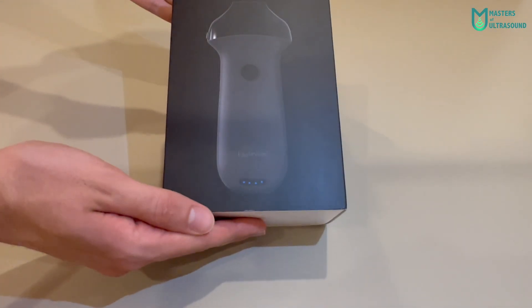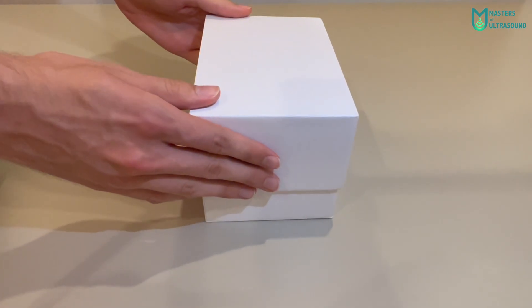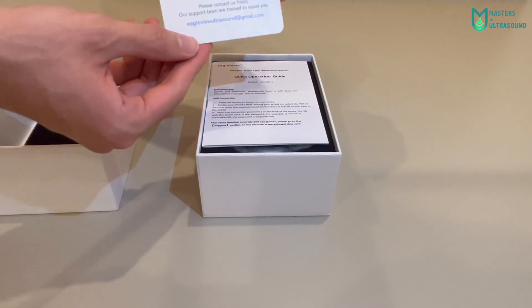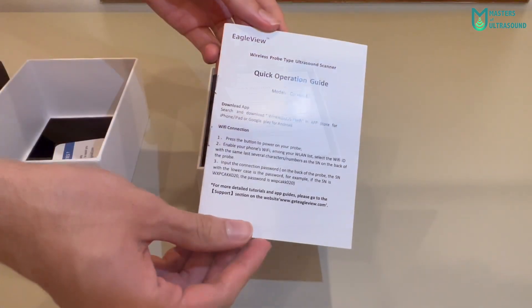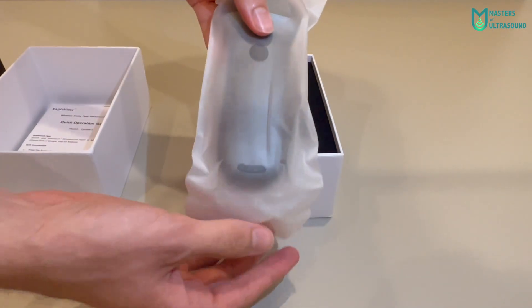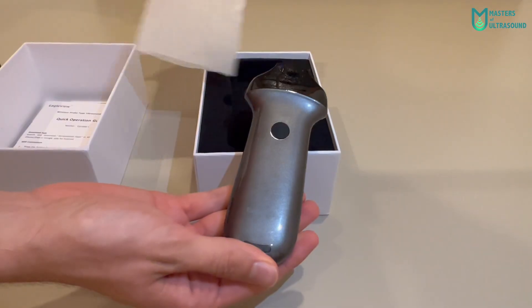Let's go with the unboxing. Here it is, the box directly from the package. Removing apart the cover, there is a white box. After opening it, the first thing is the warranty card, which is 18 months, not extendable, the quick operation guide, and the probe itself — in a shiny dark grey, really beautiful and stylish in my humble opinion.